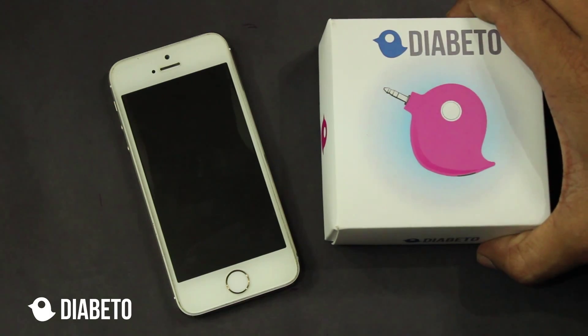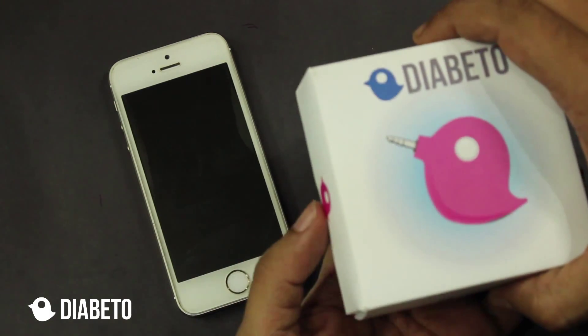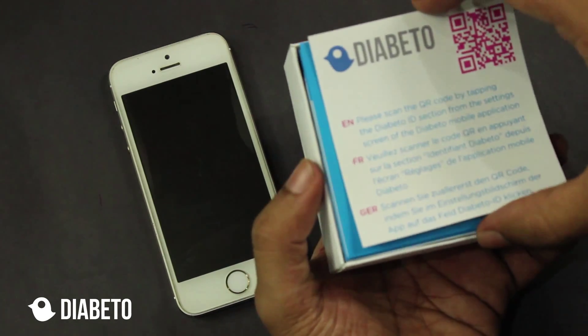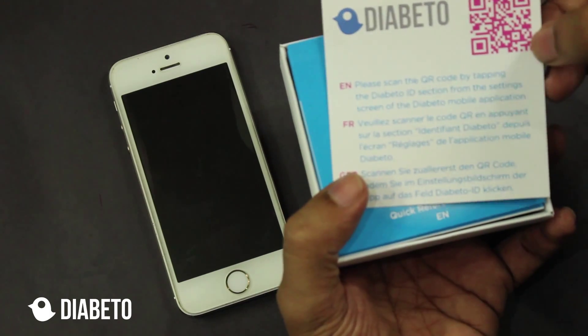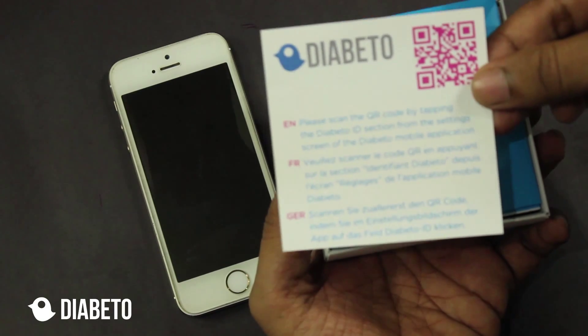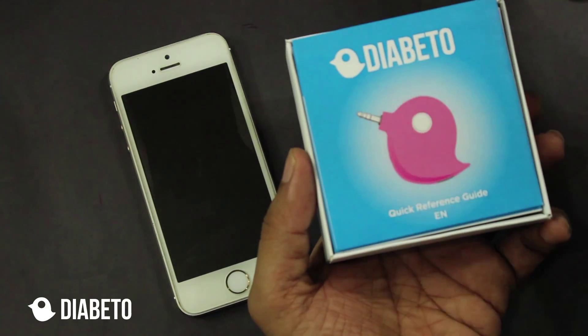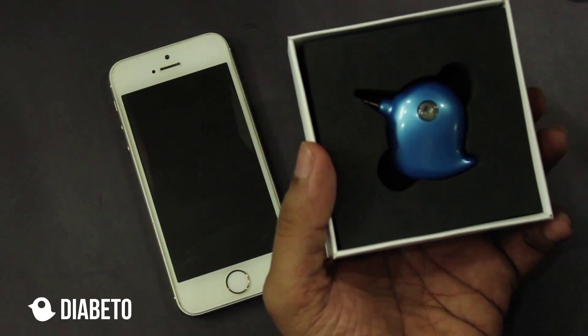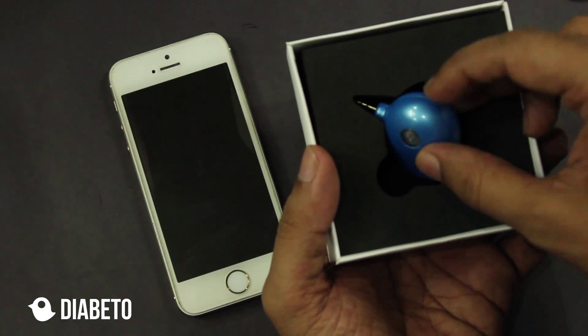When you have received the Diabeto hardware, just open the beautiful box and you will see that there is a paper insert with this funny looking code. This is a very simple as well as important paper. I keep it aside, and second is a quick reference guide.